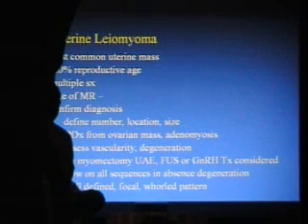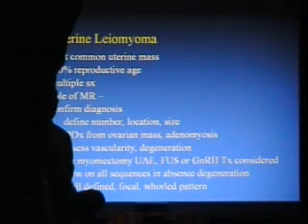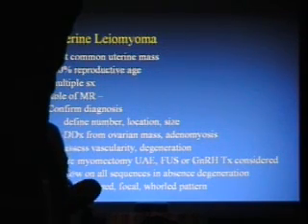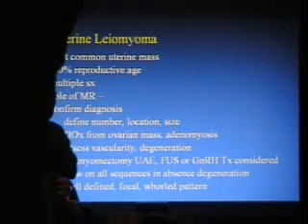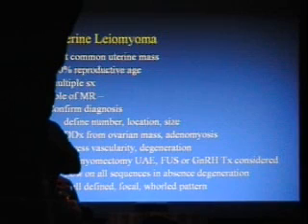And for that reason, we now give all intravenous gadolinium when we're scanning them on MR for fibroids because we're particularly interested in degeneration. There is no point in doing uterine artery embolization or other treatments if the fibroids are completely necrotic already. If they've already outgrown their blood supply, you're really not going to do a lot by embolizing them further. You're just going to cause myometrial infarction, a lot of pain, and probably not a lot of symptom improvement. Degeneration we'll come back to a little bit in a second. And so treatment planning is really our major role. Let's look at some cases.